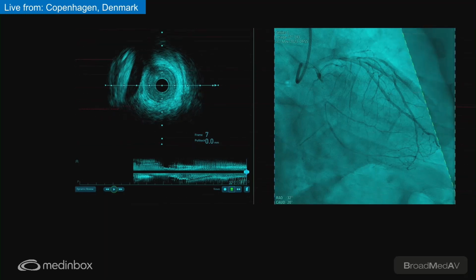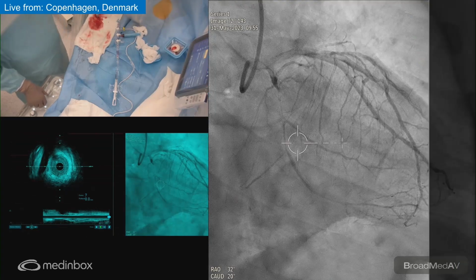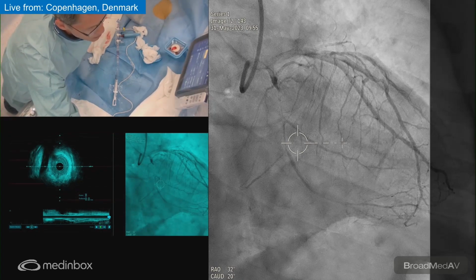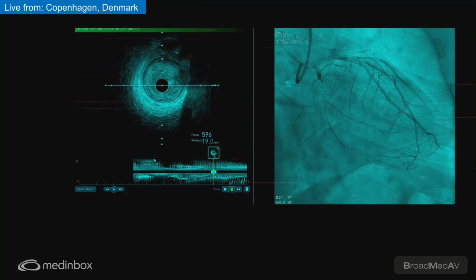We probably need to stent all the way down to that side branch. Can you show some measurements on the screen? I don't know whether you can see the reference image right now, but we probably will need to stent across the bifurcation with the marginal, but also across the next bifurcation, as there was quite a lot of plaque down there. Now this is the distal cap of the CTO.